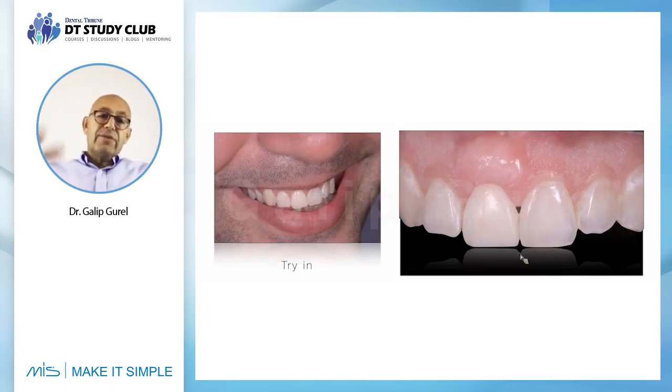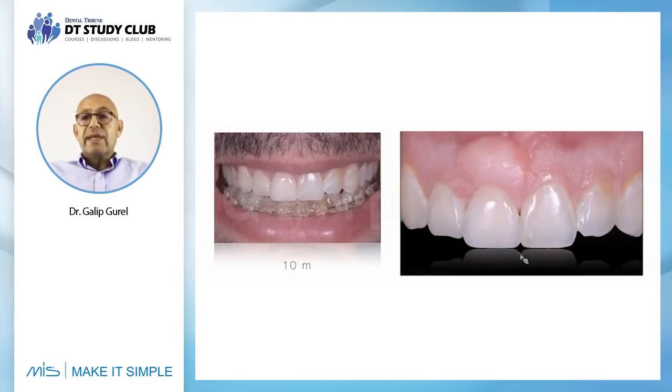So this is the provisional that we're trying in, and it seems beautiful. And then we place the implant, and this is the condition of the implant after 10 months.